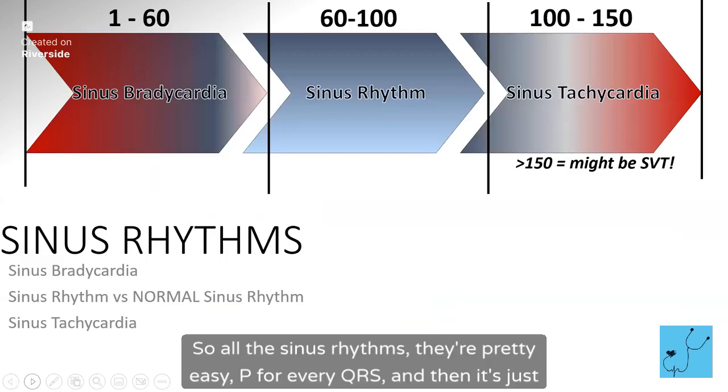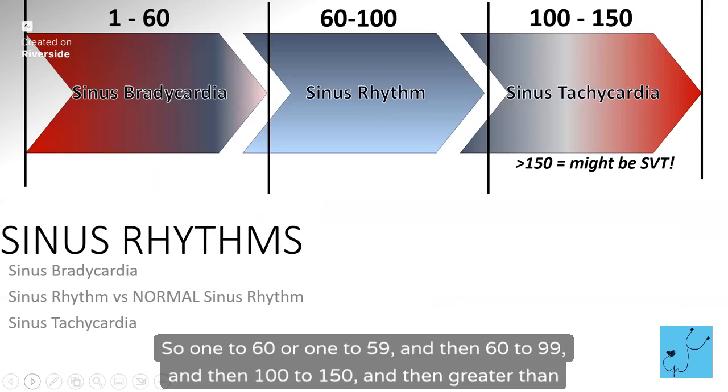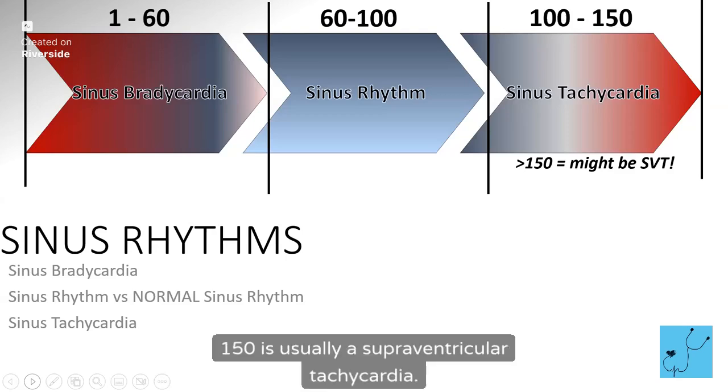So all the sinus rhythms are pretty easy: P for every QRS, and then it's just about the rate. So 1 to 59, and then 60 to 99, and then 100 to 150, and then greater than 150 is usually a supraventricular tachycardia.